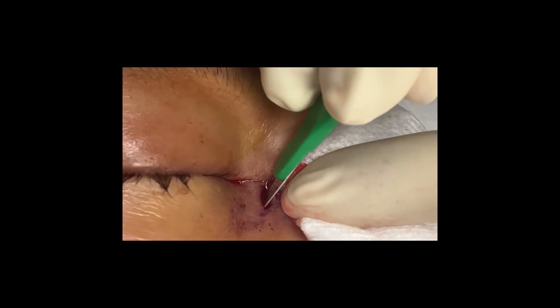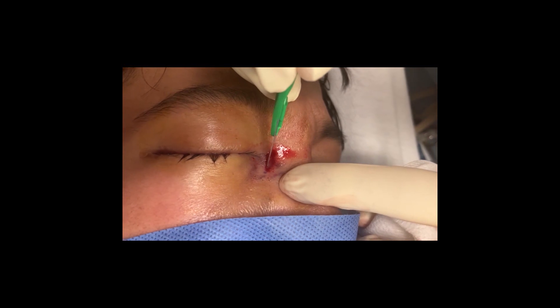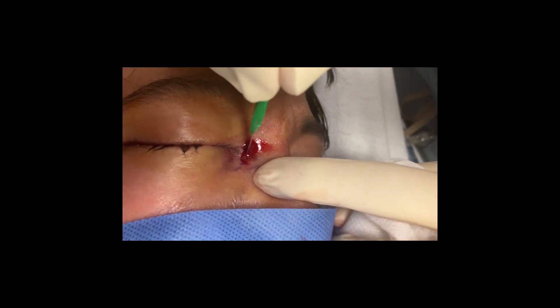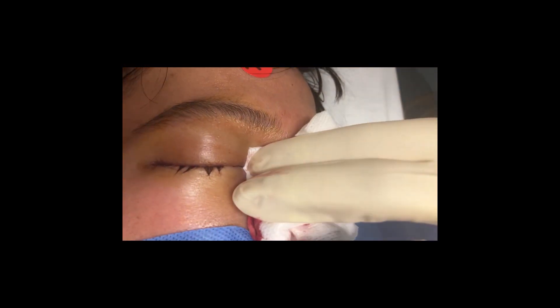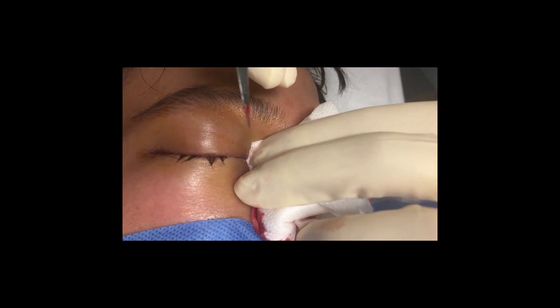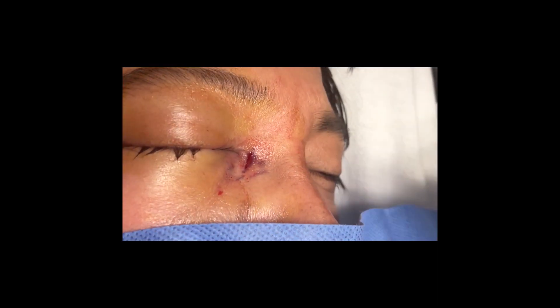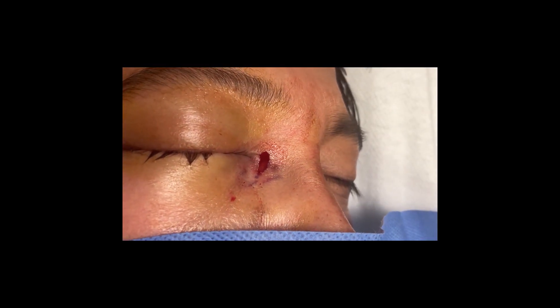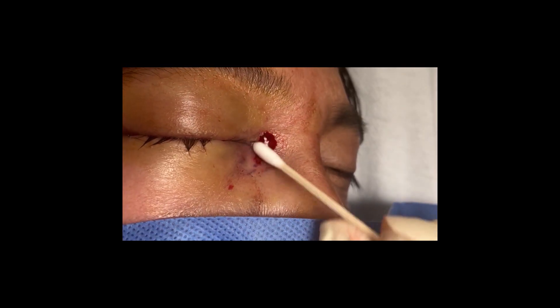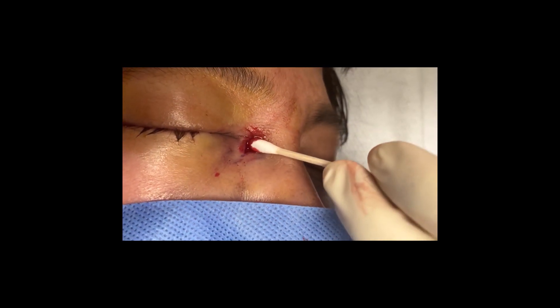In this case the abscess is not as superficial as some. The incision should be about one centimeter in length. You can usually palpate the abscess and place your marking over that area. The blade should be directed posterior and medial. In this case the incision needs to be made a little deeper than usual.